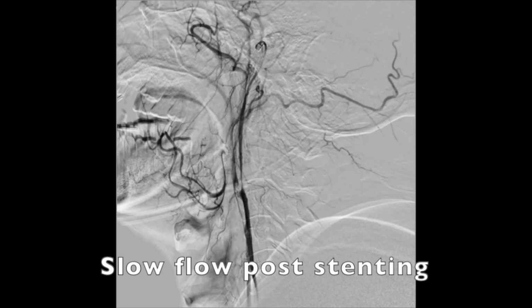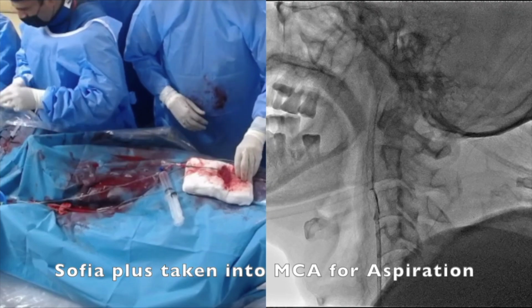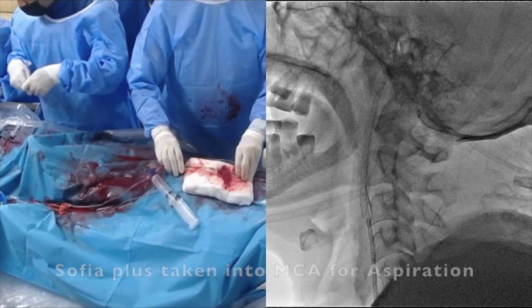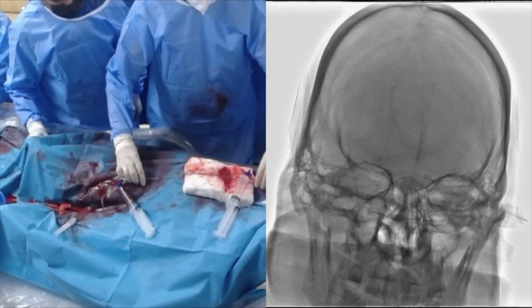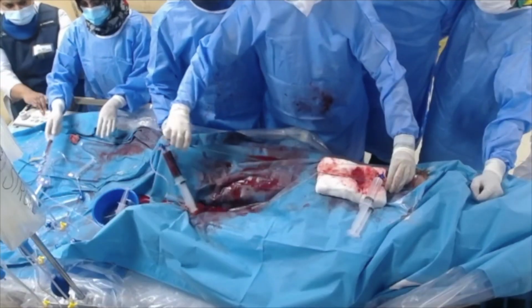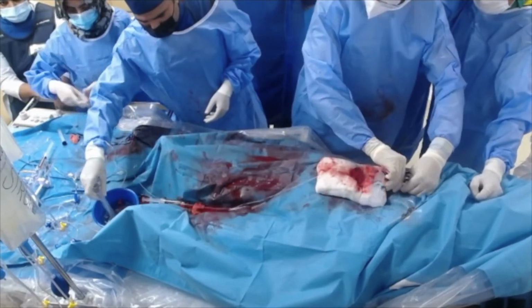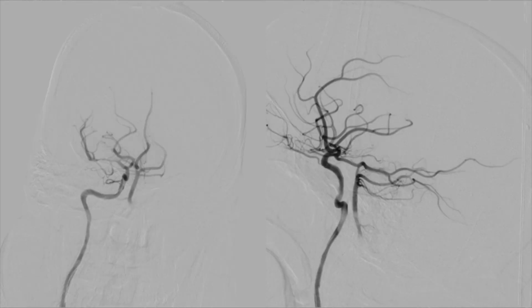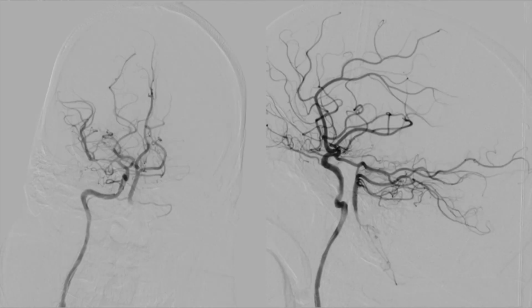So the next thing I did was I again took my Sophia Plus up and aspirated through the stent and into the internal carotid, and then took it all the way into middle cerebral artery, and from there we did the whole aspiration process again. We did ADAPT, we did not use the stent retriever, and after we pulled the Sophia out with ongoing suction, we saw that we had good flow going into the carotid and into the cerebral circulation, although there was still an element of what I thought was more spasm as compared to anything else.